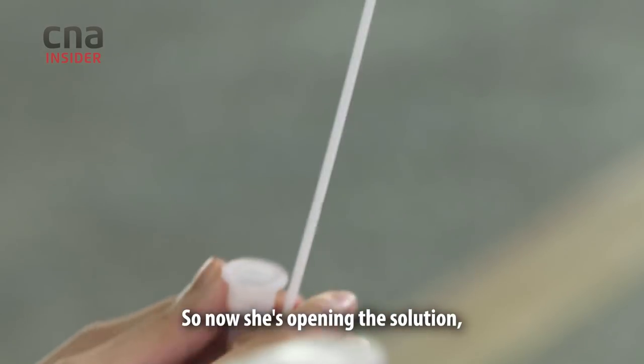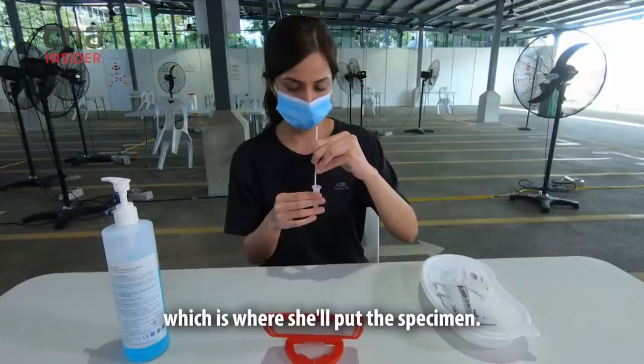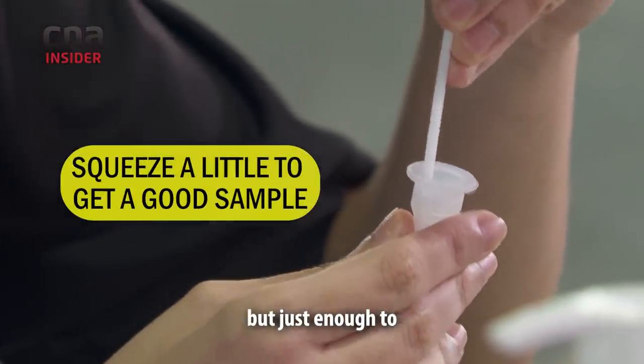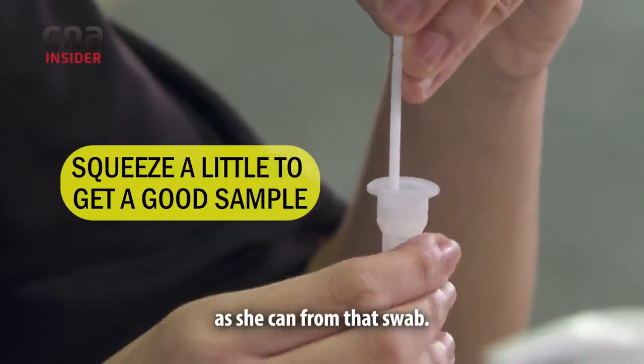Now she's opening the solution, which is where she'll put the specimen. Again, it's another 10 swirls. She's just squeezing a little bit — not too hard — but just enough to really try and get as much material as she can from that swab.